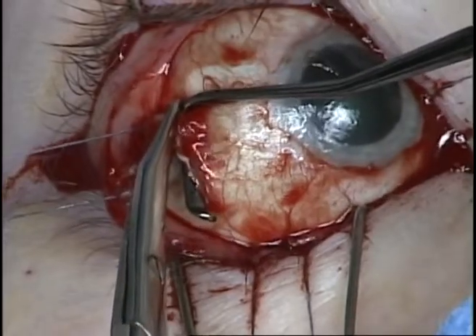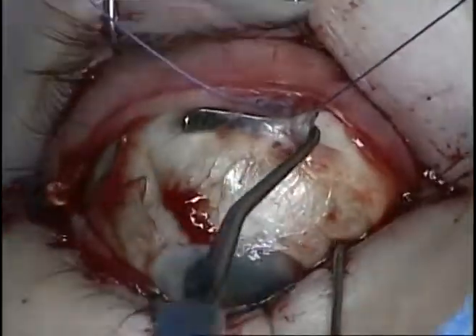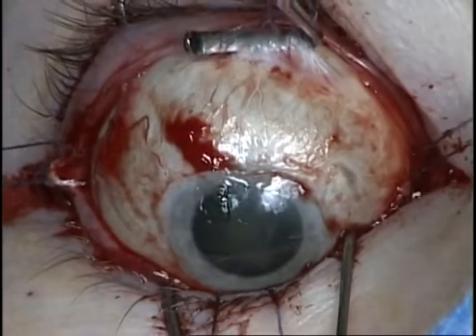The superior rectus muscle is then identified, hooked, tagged, and disinserted from the globe flush with the sclera.